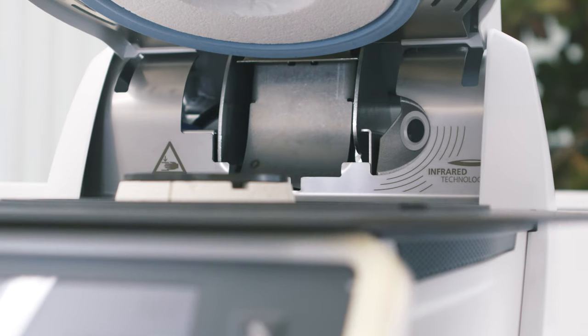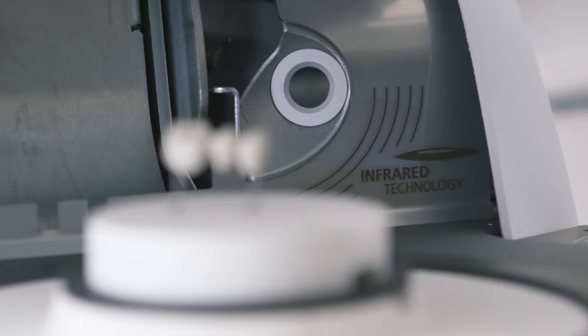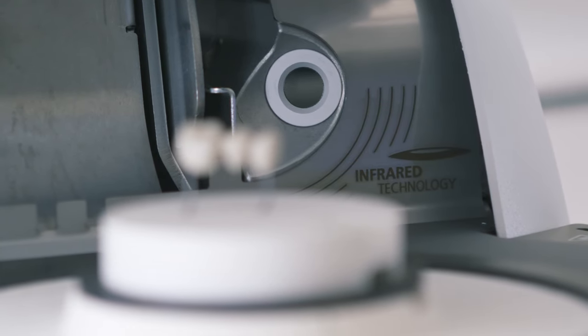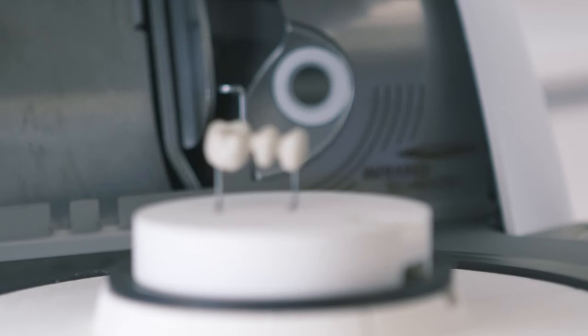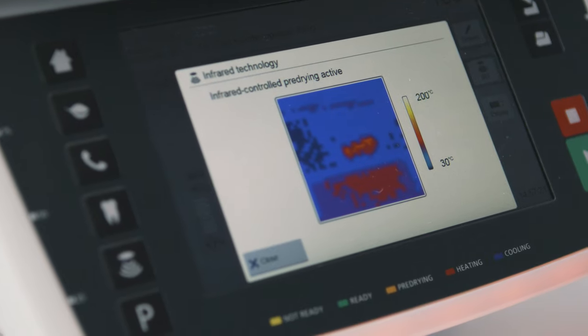The high quality of the firing results provides convincing proof of the technology's effectiveness. The integrated thermographic camera is sensitive to infrared radiation and measures the temperature directly at the surface of the objects being fired.